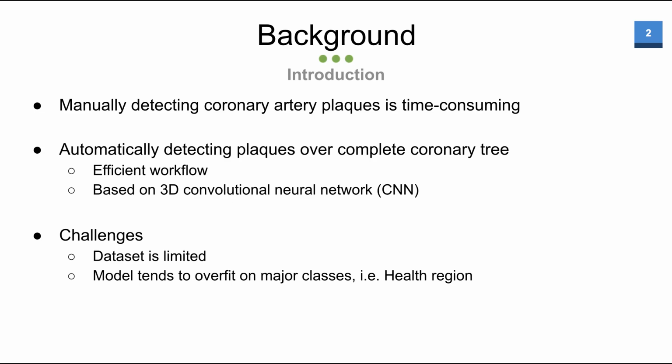CCTA is one of the most common assessments of cardiovascular disease. However, manually detecting plaques over the complete coronary artery tree is time-consuming. Therefore, we aim to develop a fast workflow for automatically detecting coronary plaques based on a deep learning algorithm.